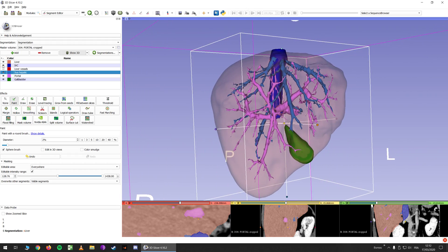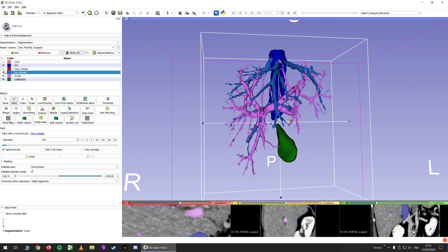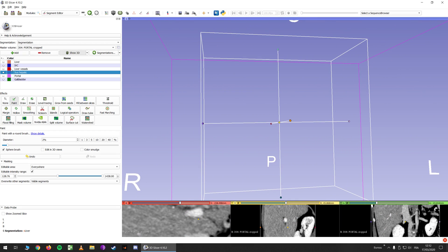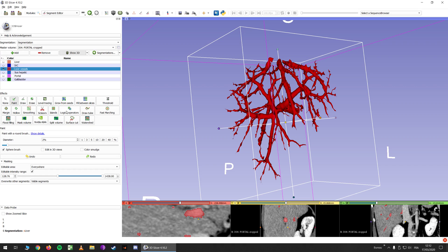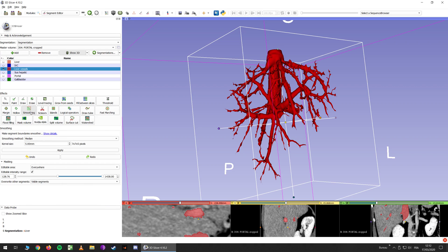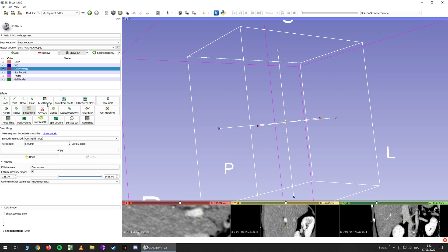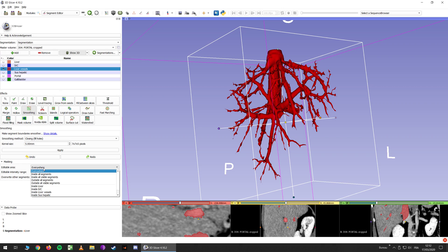The first thing we may want to do is to have a smoother segment. So what you can do is go into your liver vessel segment — you can add inferior vena cava if you want — and click closing fill holes, then apply. You don't want to have the tabular option clicked, so click apply everywhere.